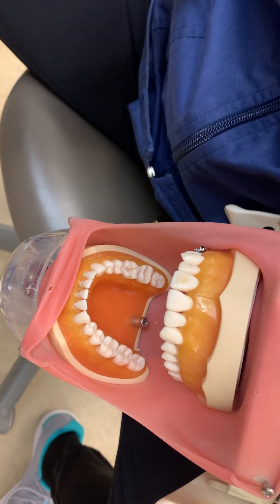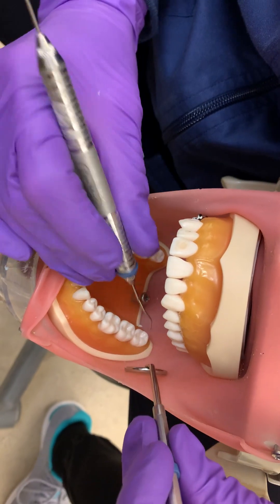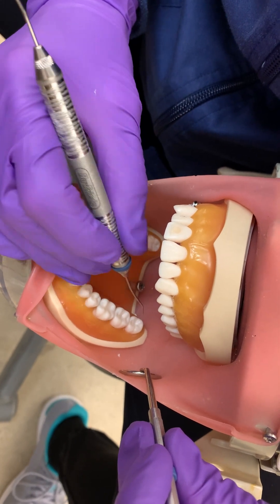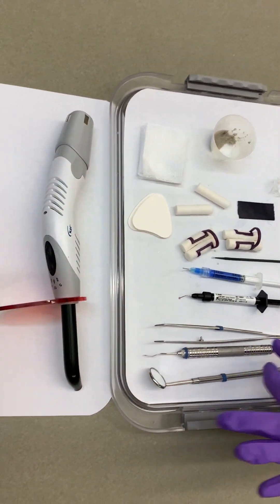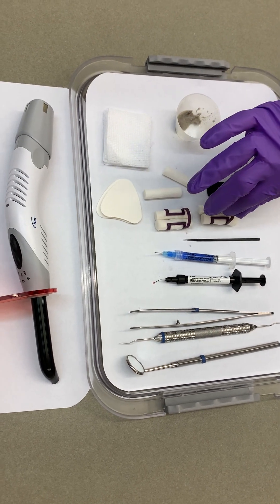We're going to evaluate each individual occlusal surface for sealant application for removal of calculus, stain, and plaque. We're going to assemble the appropriate armamentarium and maintain the chain of asepsis throughout the procedure.